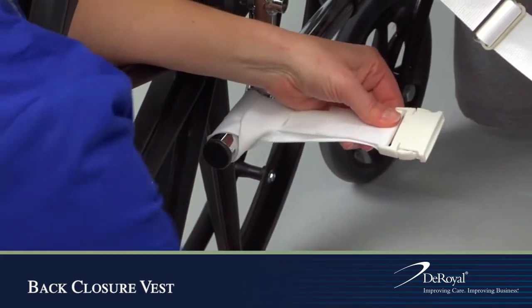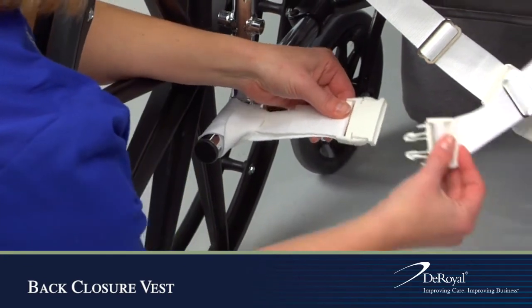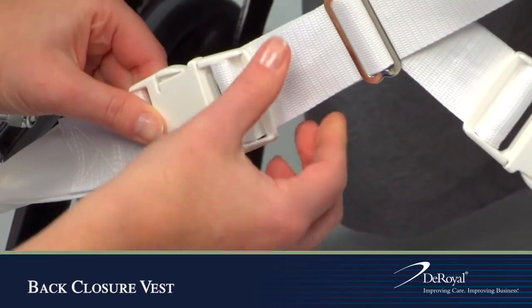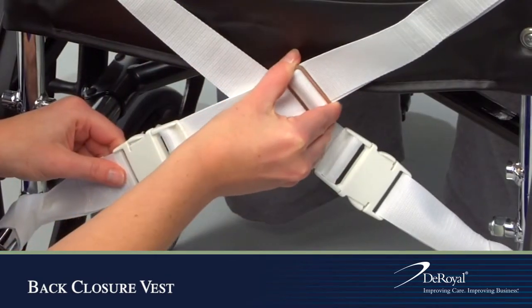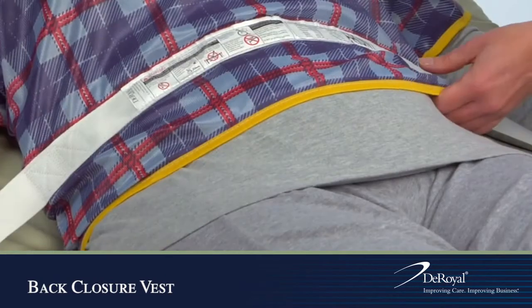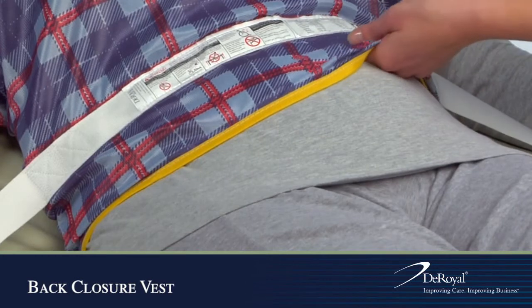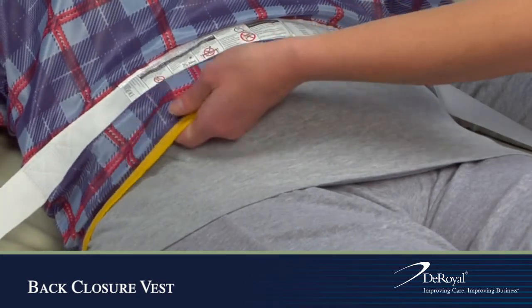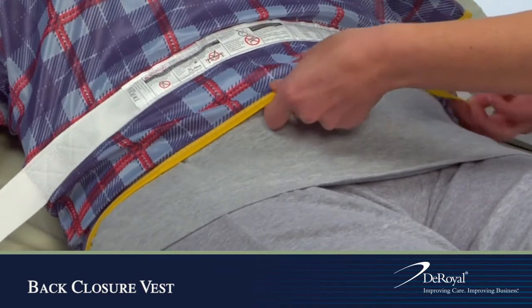Secure straps to the wheelchair tilt bars and secure by connecting the male and female ends of the buckle. Do not over tighten. Your hand should fit comfortably between the device and the patient to ensure circulation is not compromised.